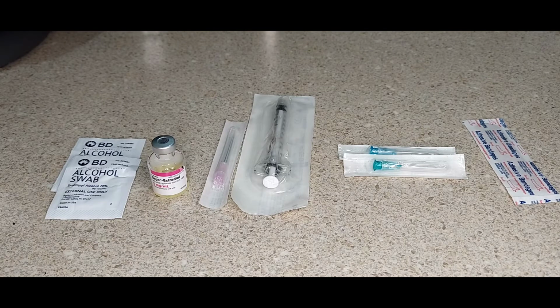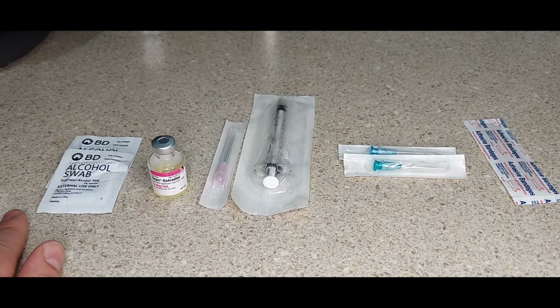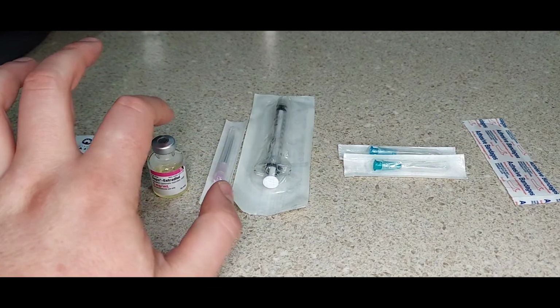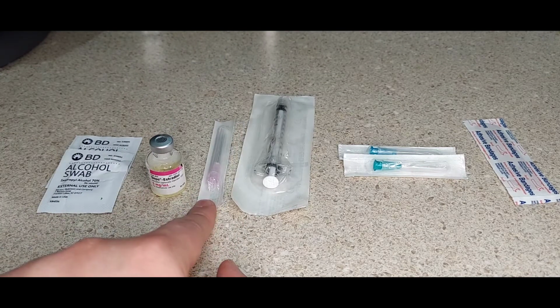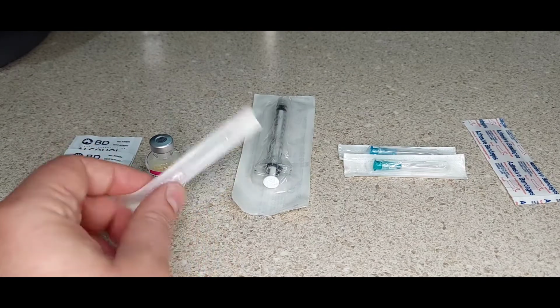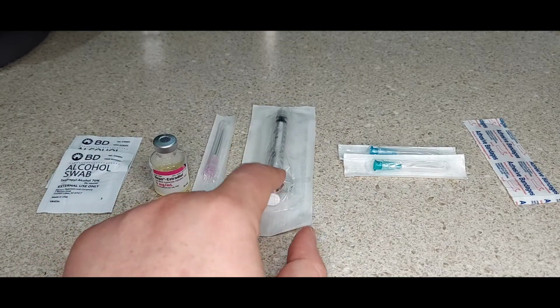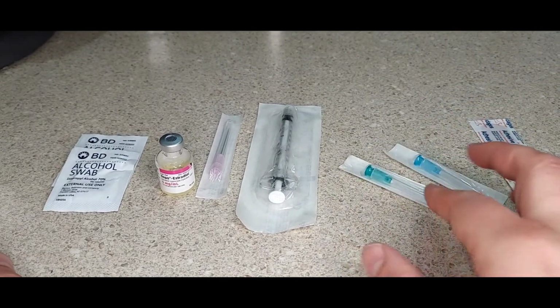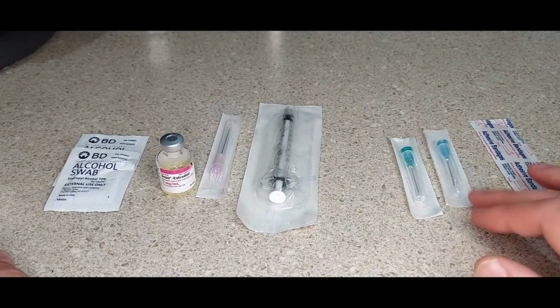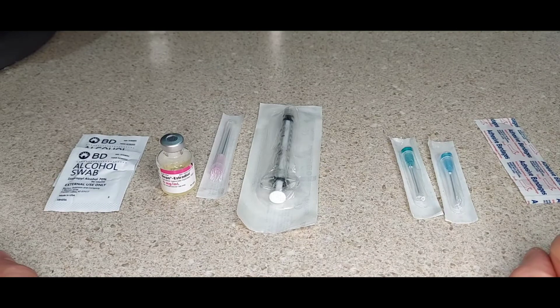So here we have all of the things that we're gonna need today. We have two alcohol swabs so that we can sterilize both the actual vial of estradiol and the skin that I will be injecting into. We have the 18 gauge needle that we use to draw up. We have the syringe that we're going to be using. And we have these needles, which are the two that I have available for injecting actually into my skin, and the adhesive bandage for the end.